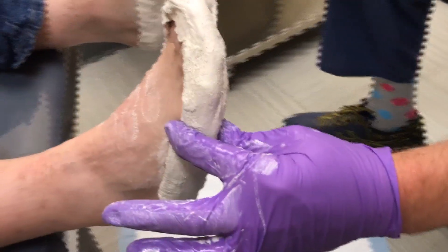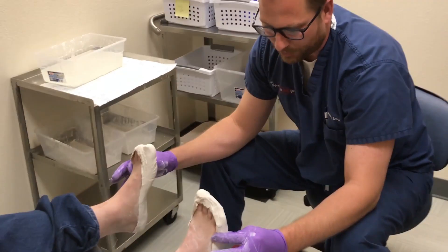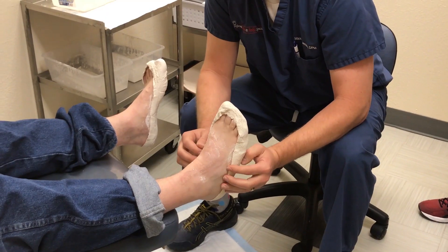There has been lots of literature dedicated to this very topic, and it has come to the conclusion that plaster casting is the gold standard for obtaining a very accurate mold of the foot.